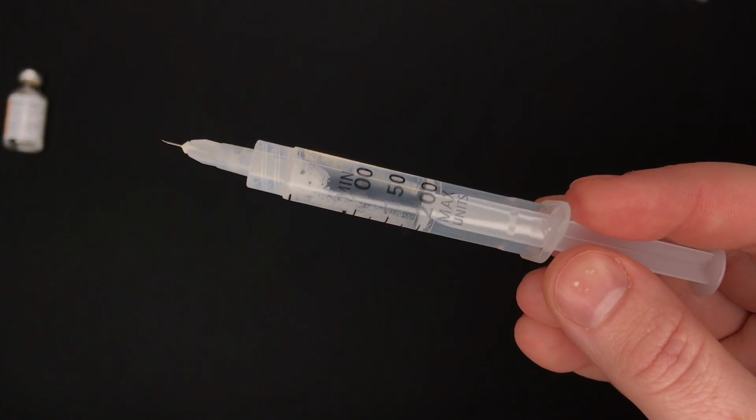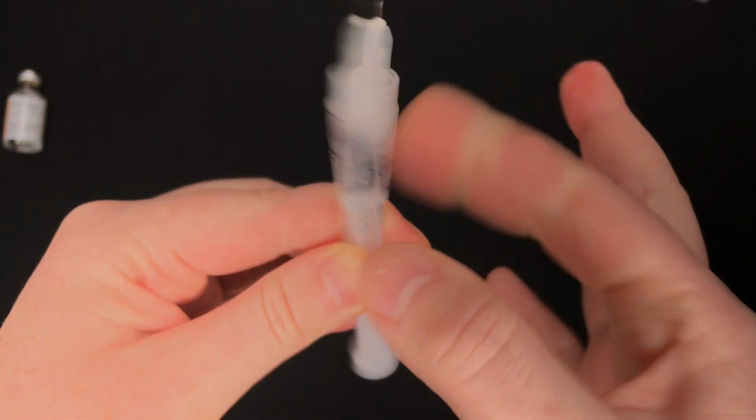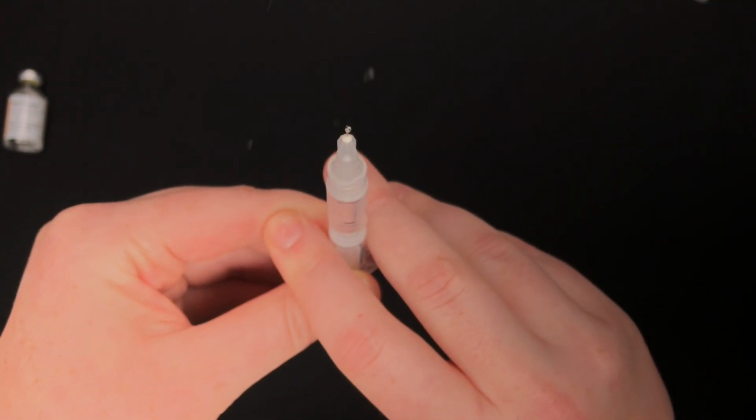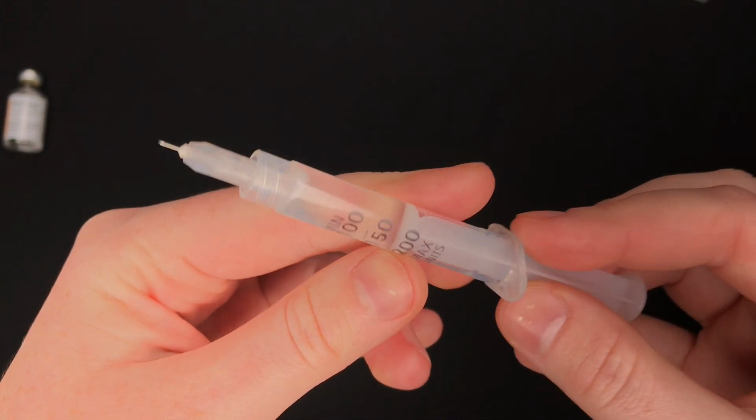If you do see some bubbles in your syringe after you pulled out some insulin, just hold your syringe upright and give it a few flicks. This will cause all of the bubbles to move to the top of the needle, and that way you can gently push out the excess air. Trust me, you do not want any bubbles in your pump.